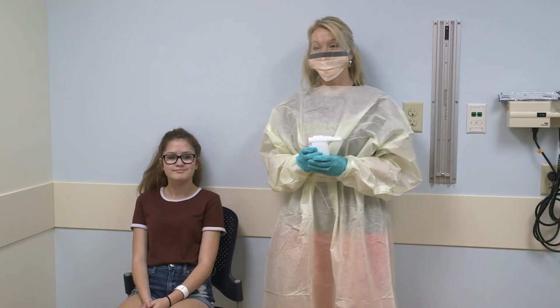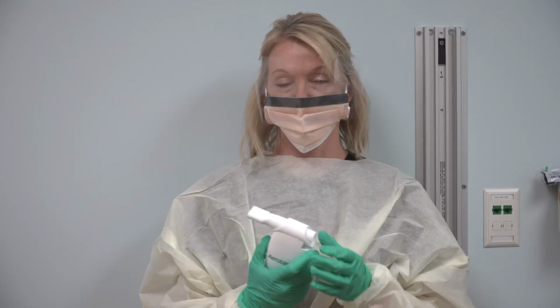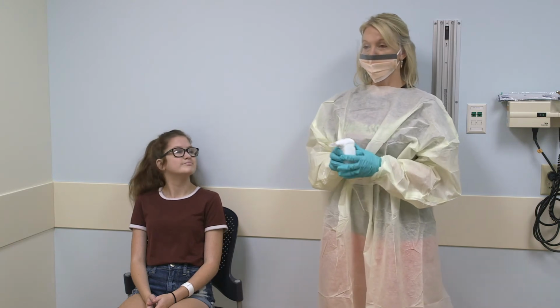Sam's going to help us out with a demonstration of Aerobika. So if we were going to start an Aerobika treatment with Sam, she would do her albuterol first, her bronchodilator, and then she would take her mucolytic, whether it be her hypertonic or Pulmozyme, whichever treatment she was on for that day. Then she would start her airway clearance with Aerobika.